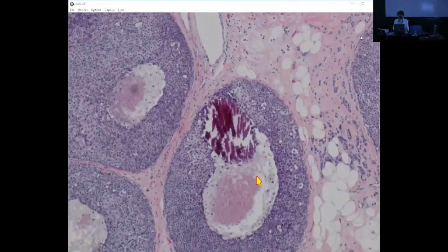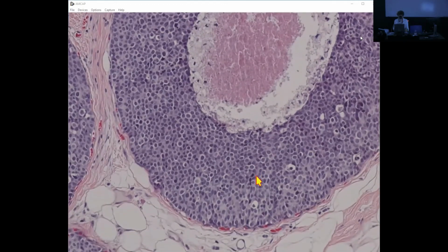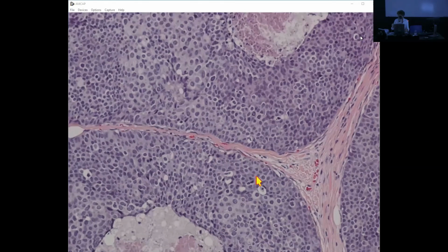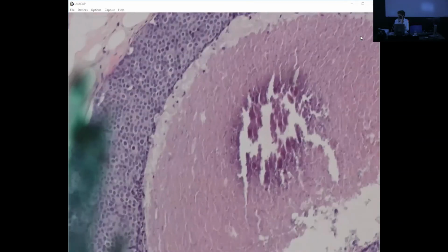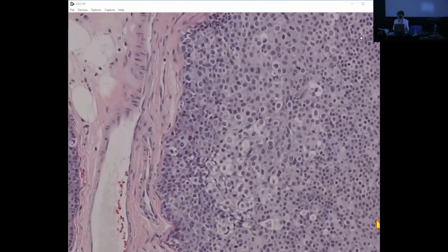It looks like it could be lobular, right? It does look fried egg-like. It has this smooth outline. At the right here, the cells are not dying the way lobular cells would, right? They have this smooth edge, there is no polarity, and just these flattened cells. So it looks lobular, but it has something funny.